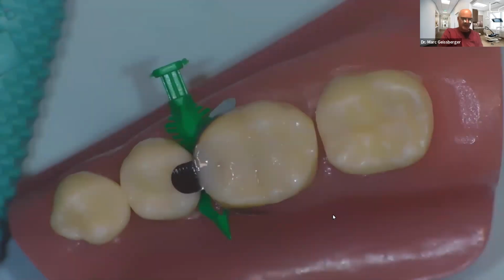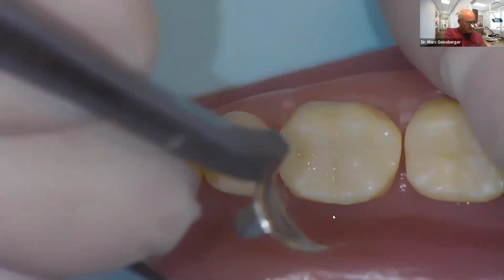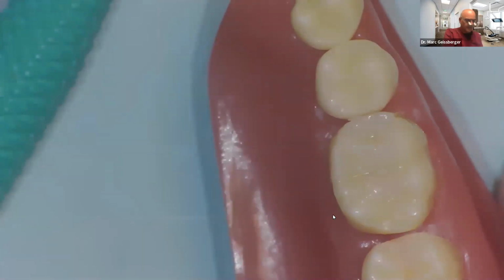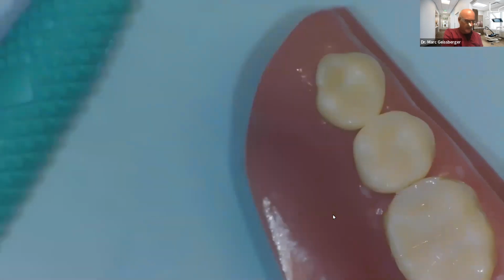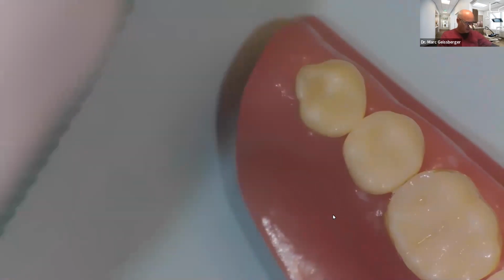Now, with that said, I'm going to pop this off. I'm going to pull out our wedge, and I'm going to grab my little tweezers. And one sign you know you've got contact is if it's a little struggle to take out, okay? So the next thing we're going to do is just show you. Now, I intentionally, remember I said I'm going to leave a little flash. If you notice there's a little flash, I did that intentionally so I can show you how to remove that very quickly.